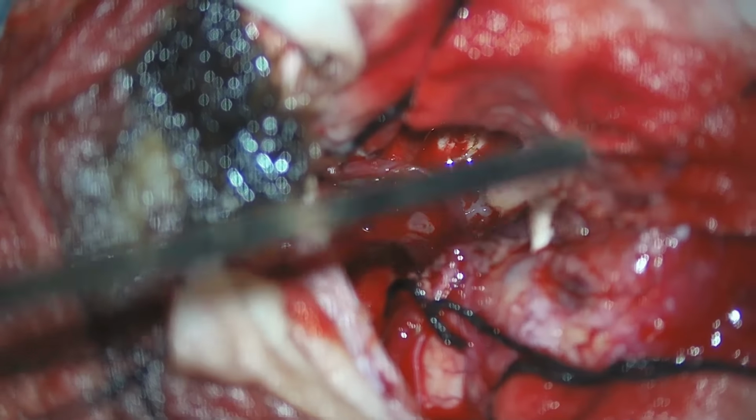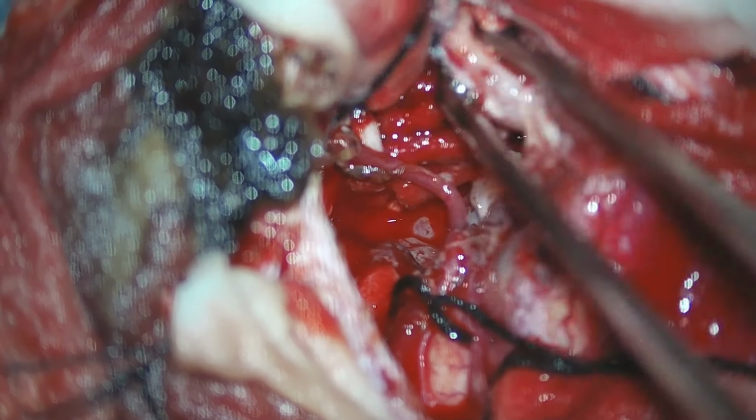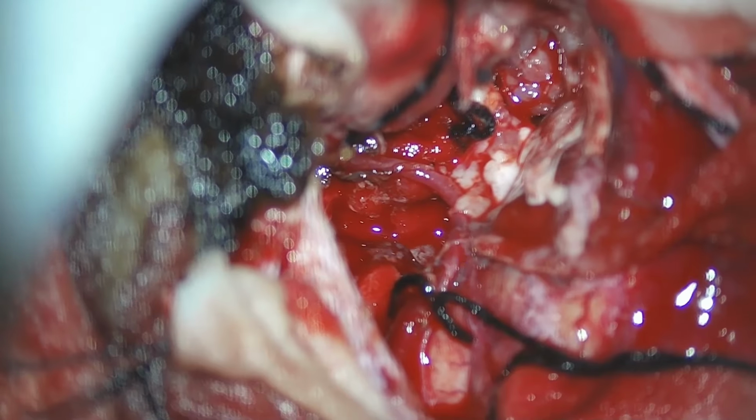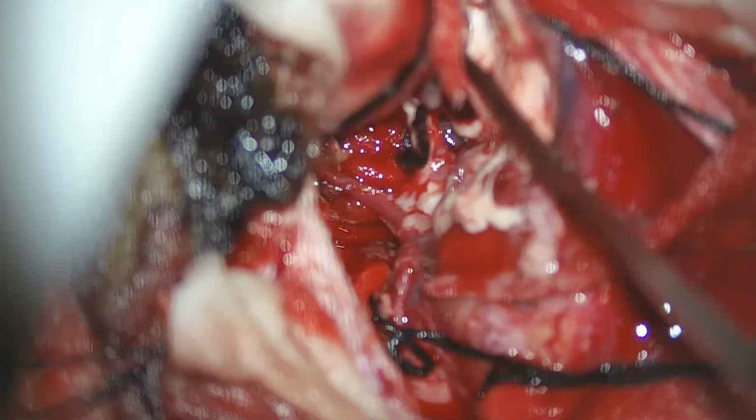And now we can see the tumor being removed from the frontal area. You can appreciate the color difference between the tumor and the normal brain.